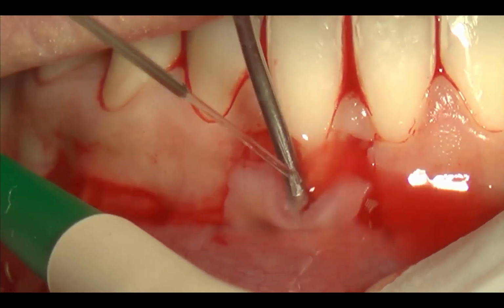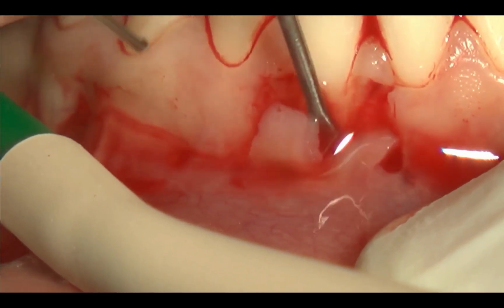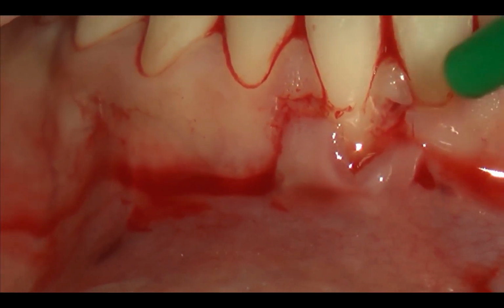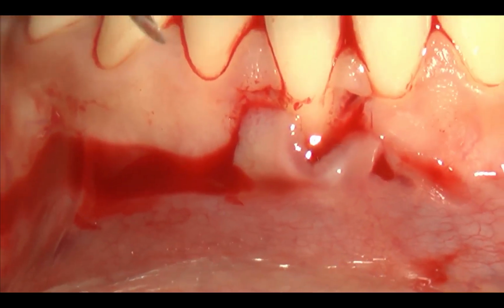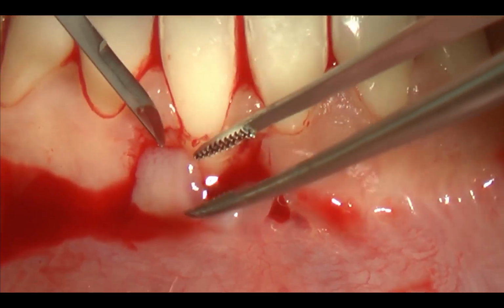And I have to feel where is the bone crest. Right. And once the bone crest is reached, I can go again.